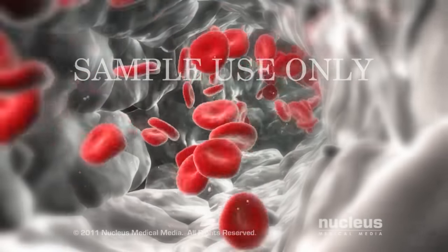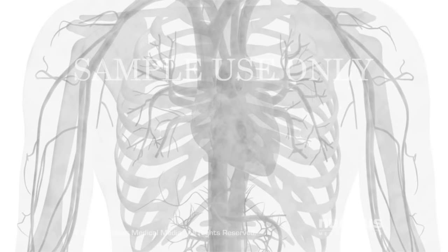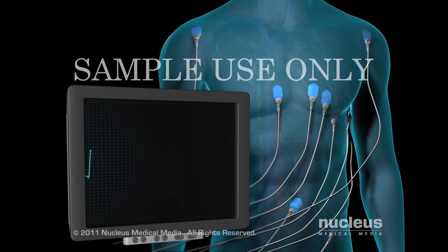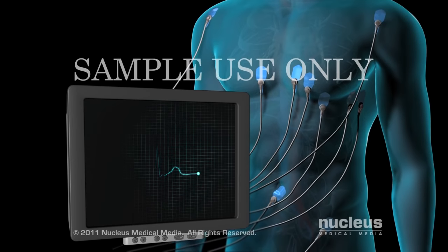Before the procedure, your blood and urine will be tested. You will also have X-rays taken of your chest, and an electrocardiogram, or EKG, will record the electrical activity in your heart.